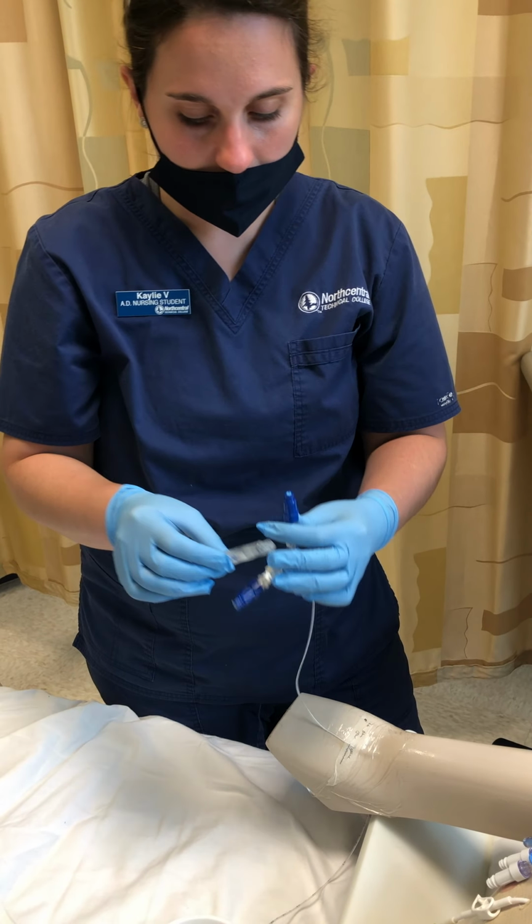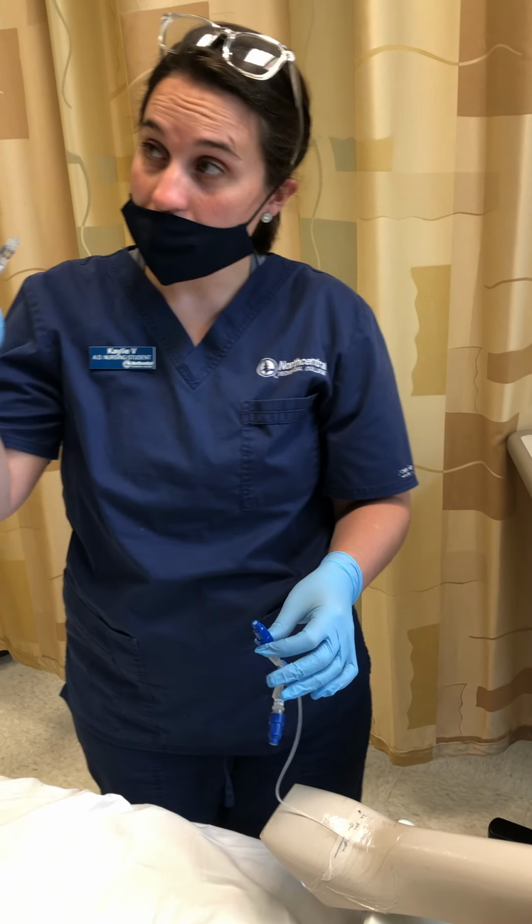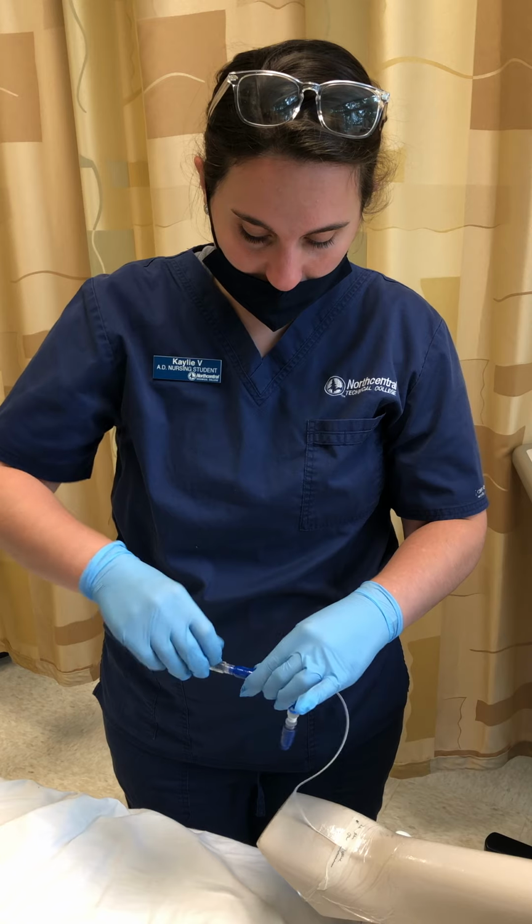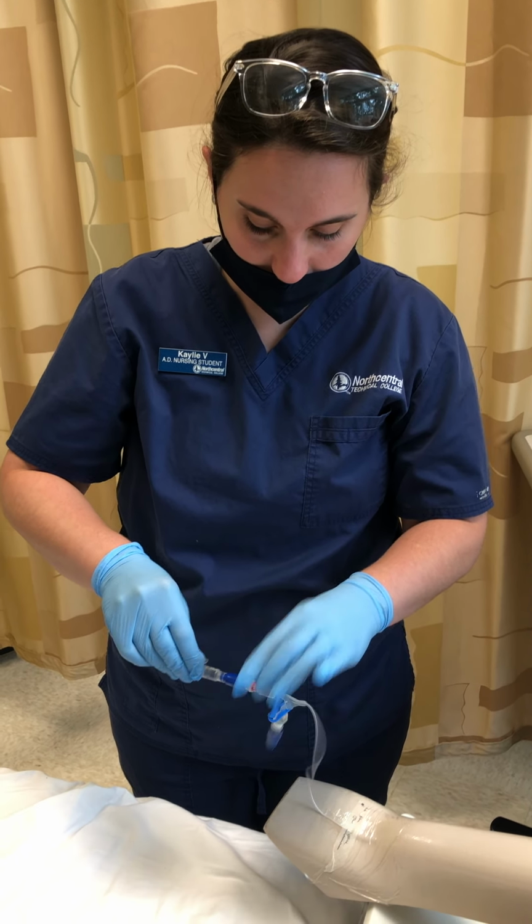All right. I'm going to be administering the lorazepam over 1 minute, so I'm going to use the clock right there. I'm actually going to remove my label so I can read the syringe better.